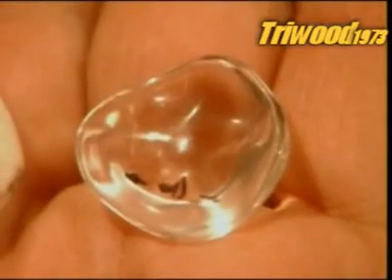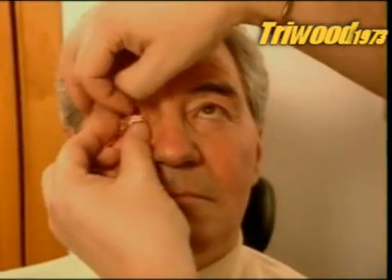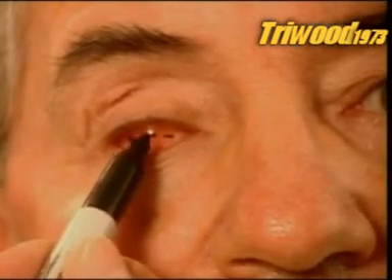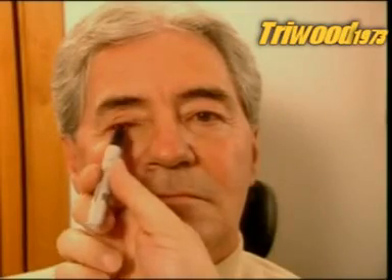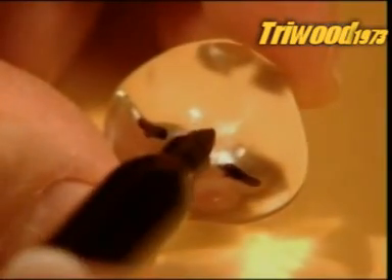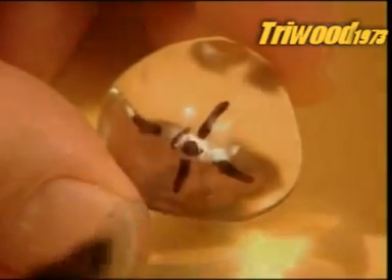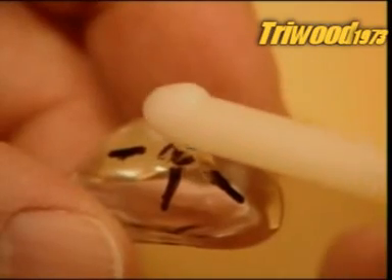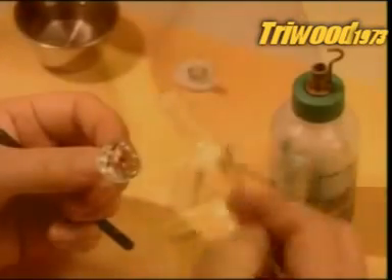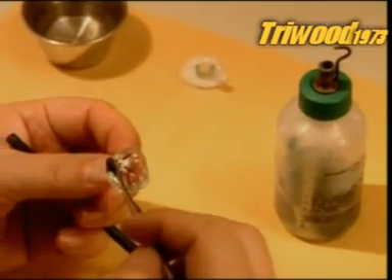This is the original impression compared to the acrylic model they've just cast. This model is called the fitting shape, because they use it to fit and mark the positioning of the fake iris. They accentuate the markings, then attach a peg with a drop of wax. The peg indicates the natural angle of the iris when the patient is looking forward. Next, they add wax around the perimeter to enlarge the fitting shape. This excess will give the ocularist some play afterwards for the final sizing.